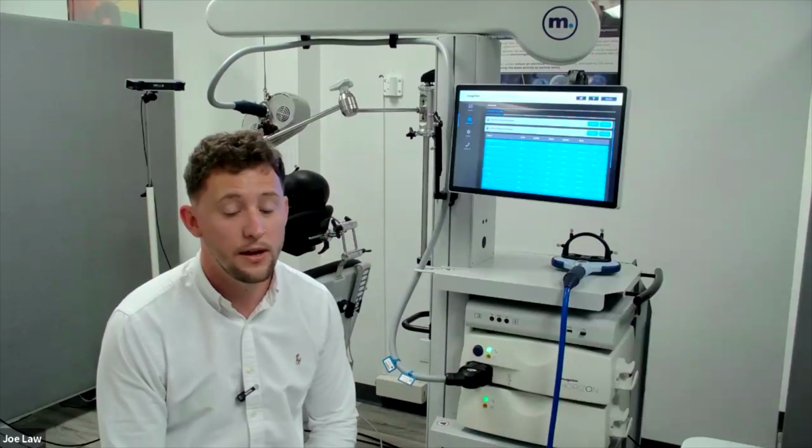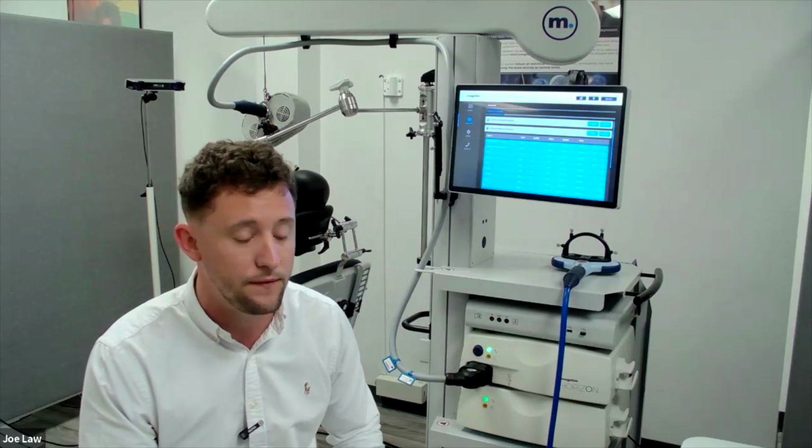Great question. So there's a couple of things we can do. We do a preventative maintenance service. It's not something that's required, but we understand some clinics have processes that need sign-off from the manufacturer. So we do have a preventative maintenance service available for our clinics. That means somebody will come out and they will do a visual and functional inspection on the system.